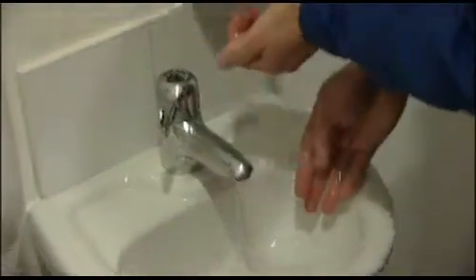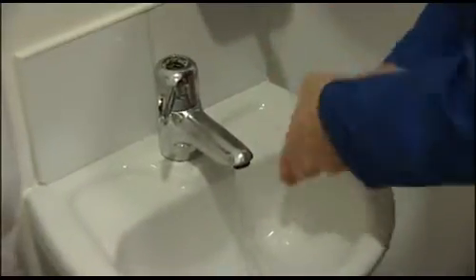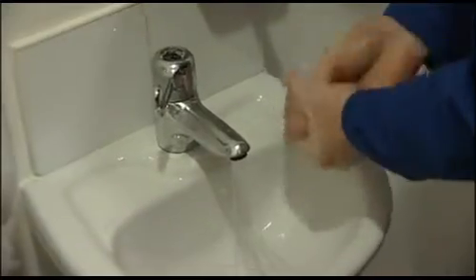Make sure that long hair is tied back and jewellery is removed so that it does not interfere with the seal to the face. Always ensure that your hands are clean when fitting a respirator. This helps avoid skin irritation that can be caused if the inside surfaces of the respirator become contaminated.